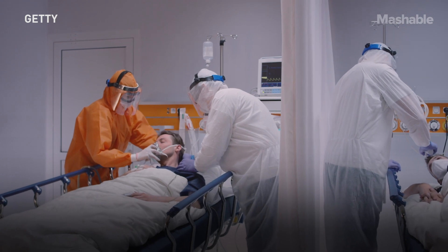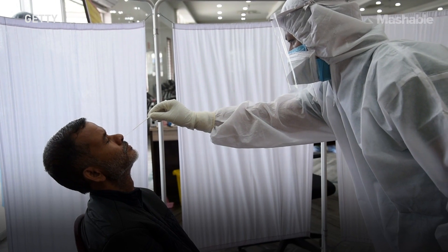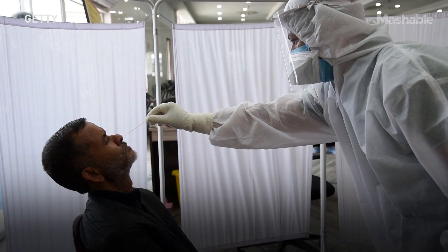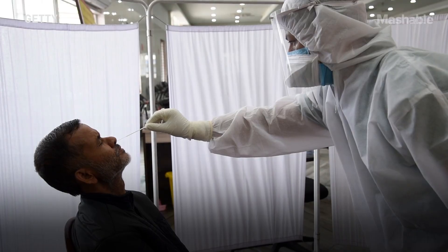In our attempt to solve certain enclosure problems with COVID, we've discovered that whatever kinds of shields you make, one of the key questions that arises is how do you get medical staff hands through that shield to do the needed tasks with as little exposure as possible. We have many solutions on the market where these shields or holes for hands to go through are either really complex and expensive to make, or they are low cost but restricted in motion — almost like having a glove entirely attached to the surface.